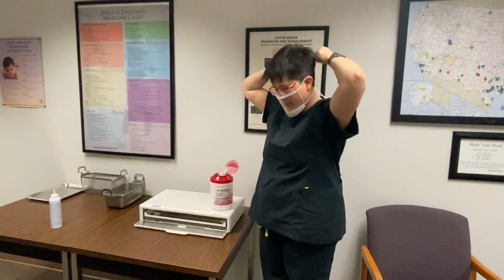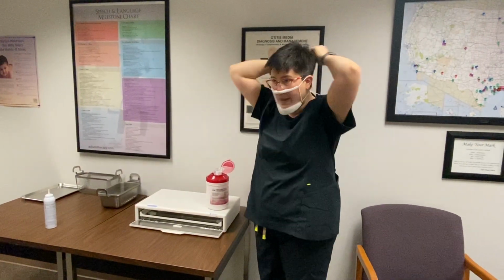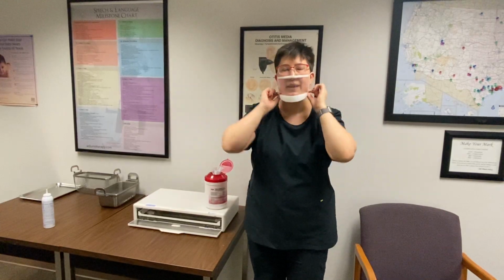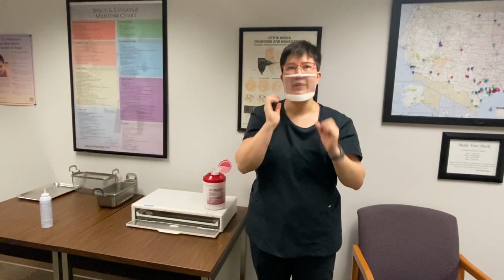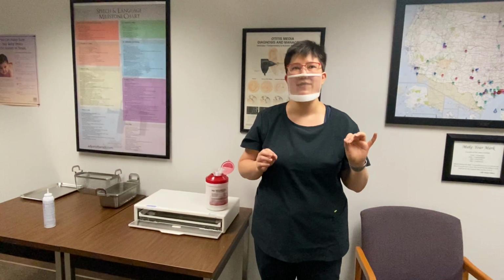The top part can be worn wherever your head holds. If you can do a bun, that's good. But you want it tight and firm so when you talk, it doesn't fall off and it doesn't make your glasses fog up. And it'll fog a little bit, so if you slow your rate of speed, it comes down.